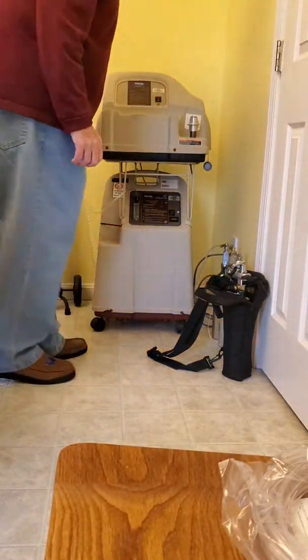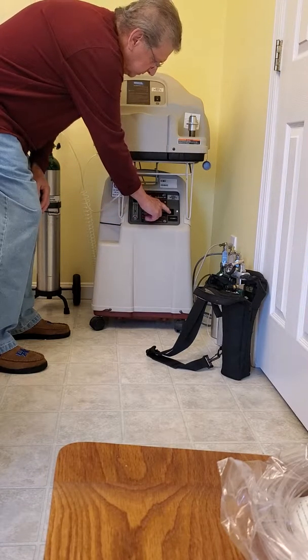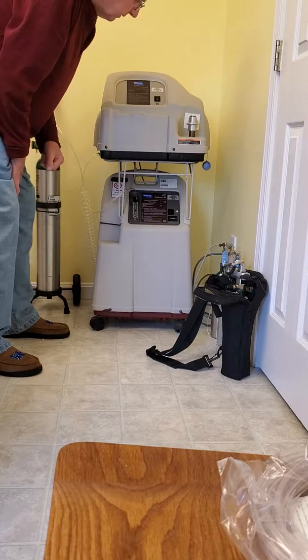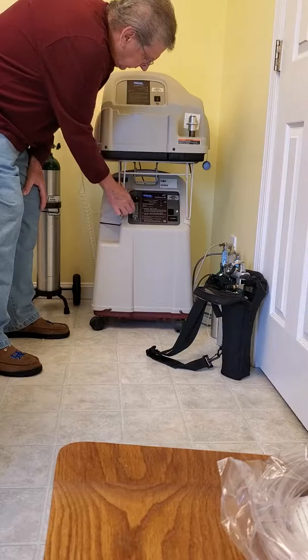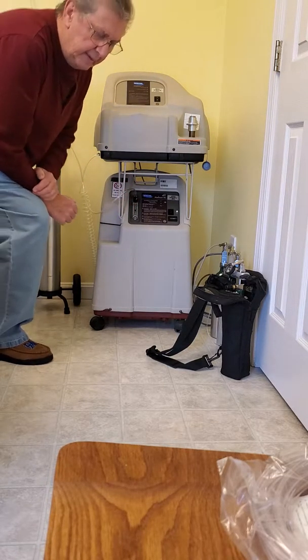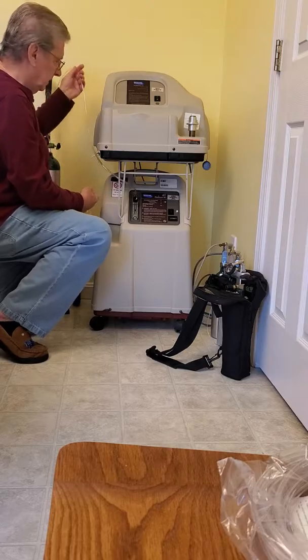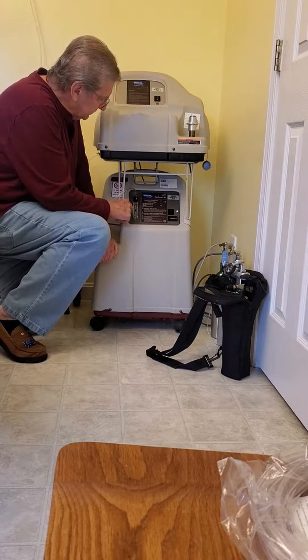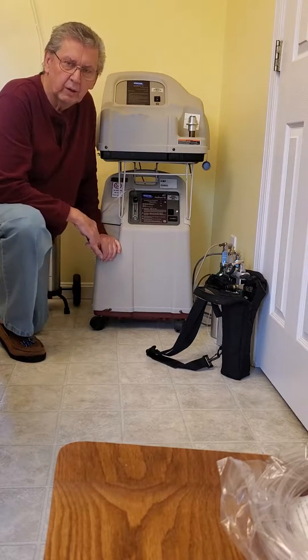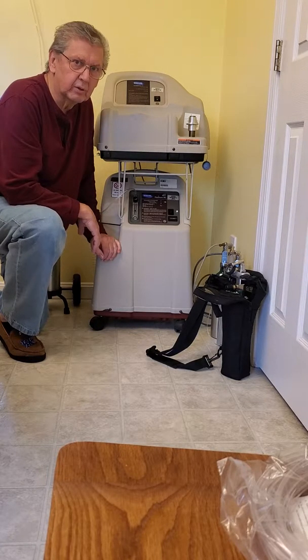The concentrator — you just plug it in. It has an easy on and off switch. It'll always sound an alarm when you turn it on, then it'll stop — that means things are working. There's a dial and a gauge showing a little bubble that tells you the amount of oxygen going through the tube. We have it set at two; that's where our doctor recommended it. Most people are at two or two and a half on that dial, but go with what your doctor recommends.